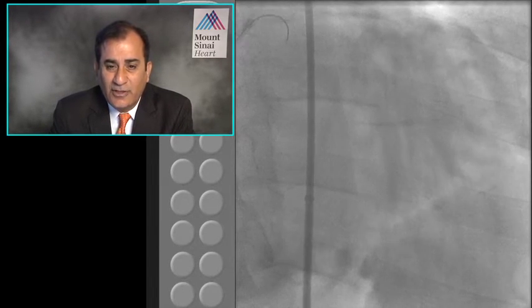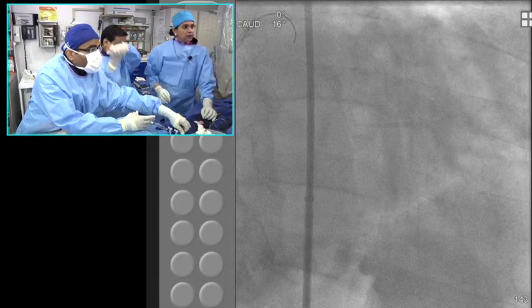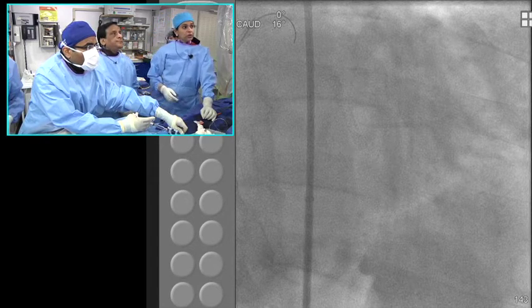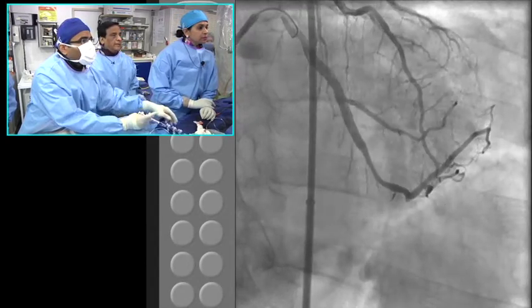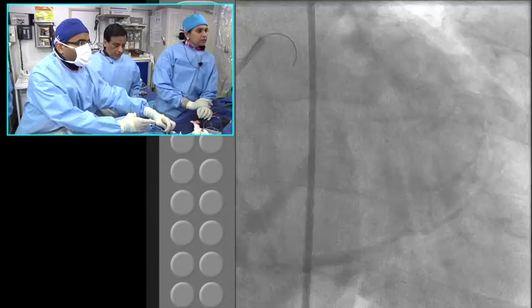Of course, it's a small side branch closure. I think if you have done imaging, you understand if there is truly a plaque, whether it's obstructive or non-obstructive. Probably on the lateral segment. I think this is the main vessel plaque probably causing it, in this particular case on the opposite wall of the side branch, the main vessel.